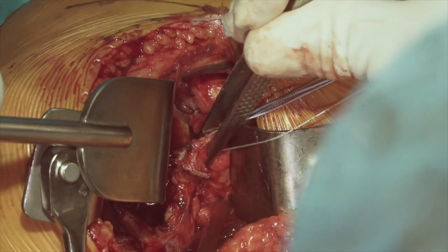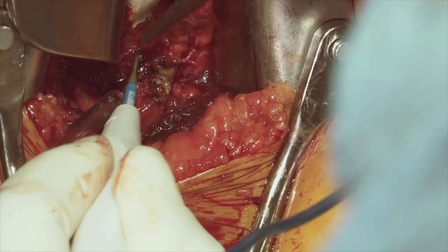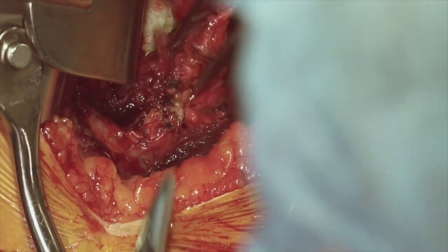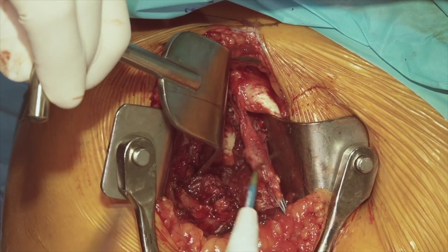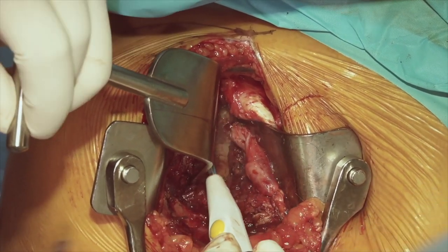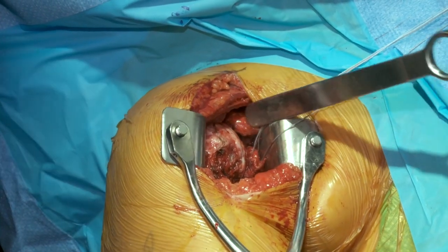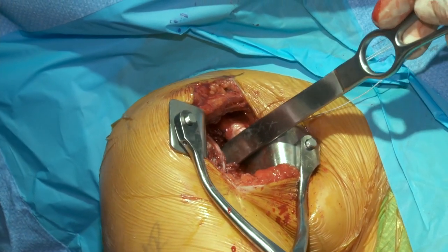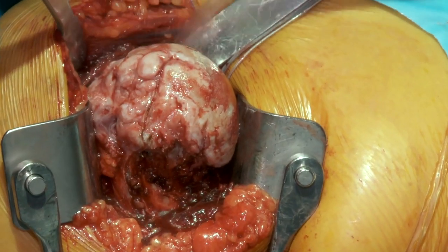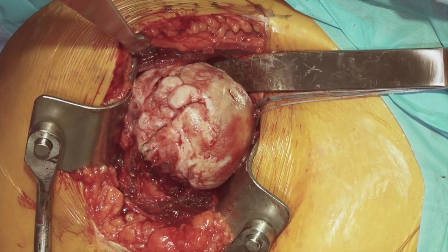Now we're going to identify where our axillary nerve is — which is down very low — and start to release our capsule at the inferior margin of the subscapularis. Then we'll take tissue from the superior aspect, underneath our coracoid, and perform our release through the middle glenohumeral ligament. Once we've done our anterior release, we'll take our Darrach retractor across the glenohumeral joint and then shoehorn the humeral head out. Essentially it's what we would refer to as a bald head with very little attached at any position.